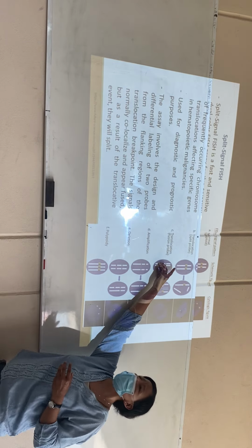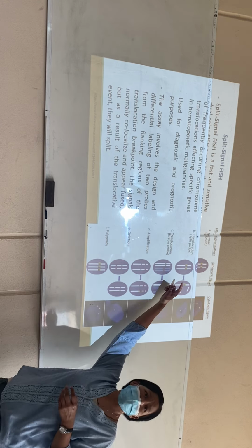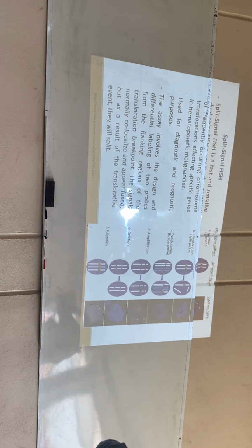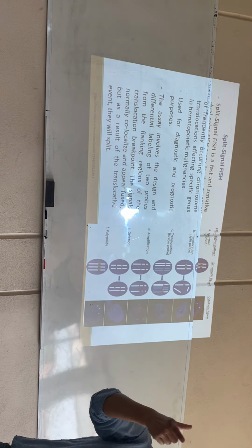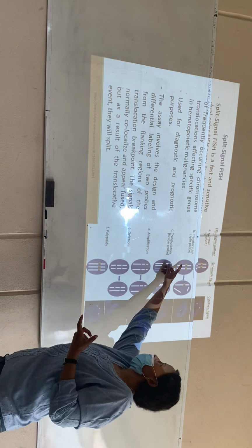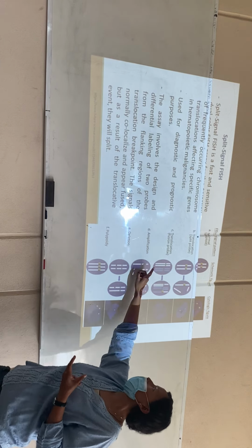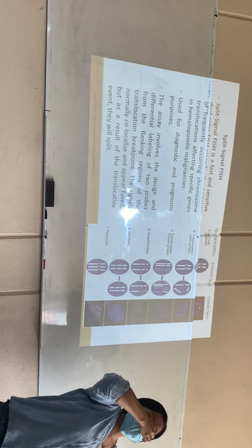So we're observing here that we can design probes directed to regions on the chromosomes that usually translocate. Basically, if the probe doesn't find that specific region or doesn't hybridize against that specific region, that means that the region was translocated to another place. So you can detect translocations by splitting the different regions, or you can identify translocation by doing fusion probes.